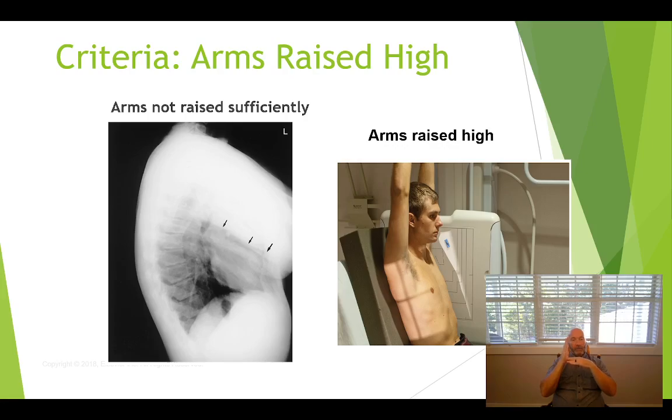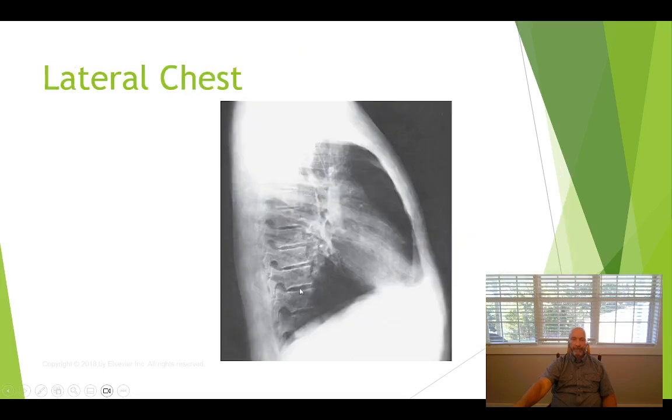You might be young and thin enough that this doesn't make a whole lot of sense to you, but most people in Northeast Texas have a gut. So the gut hits the thighs and you can't compress fluid, and it's all fluid. So what happens is that comes up and it smashes the lower anterior portion of the lungs. We'll take a look at what that does to the image here in just a bit.